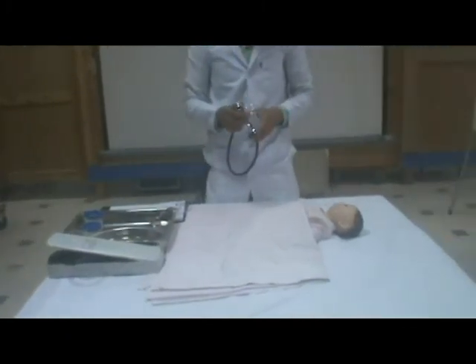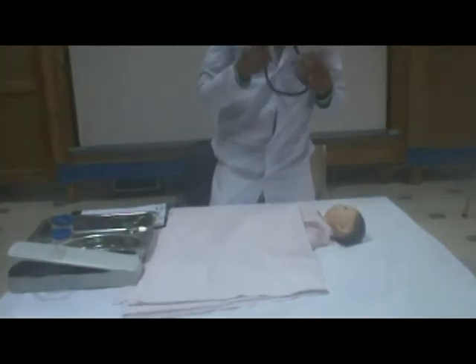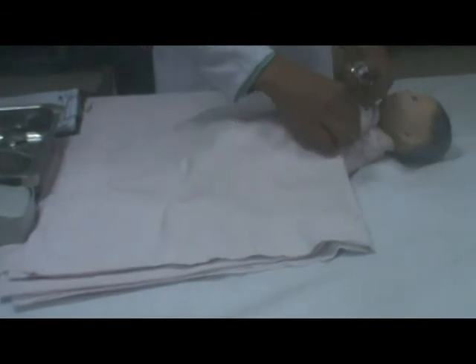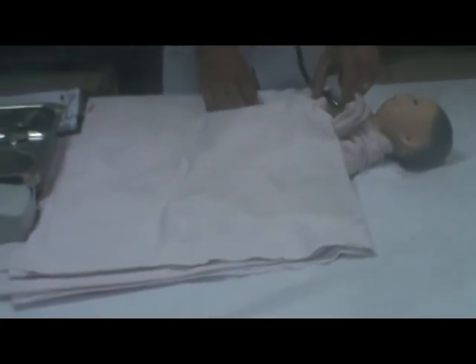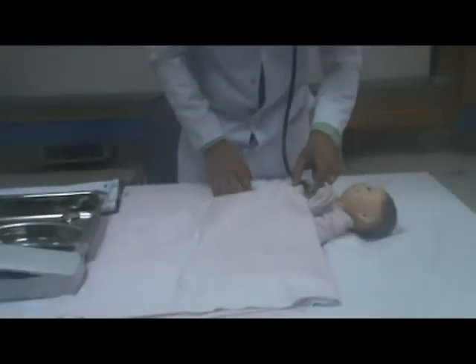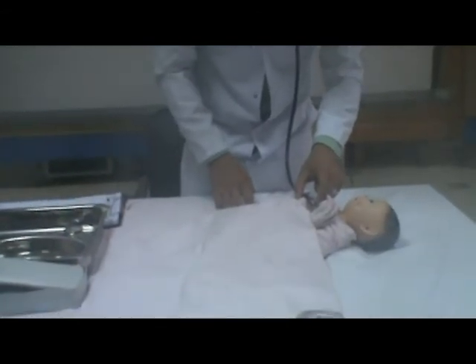Number 6, identify site, palpate the chest wall to determine the point of maximal impulse in between the 4th and 5th intercostal space. Sufficient time is required to detect irregularities or other defects. Number 7, place the diaphragm of the stethoscope on the apex of the heart in between the 4th and 5th intercostal space, as these positions are appropriate where heart sounds are best heard at these ages.